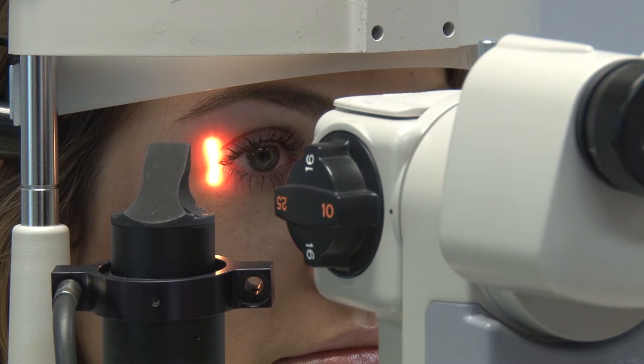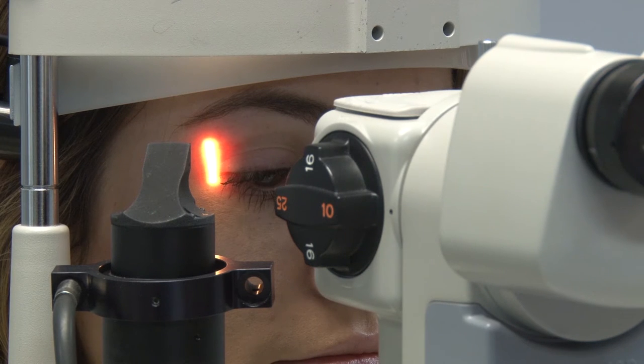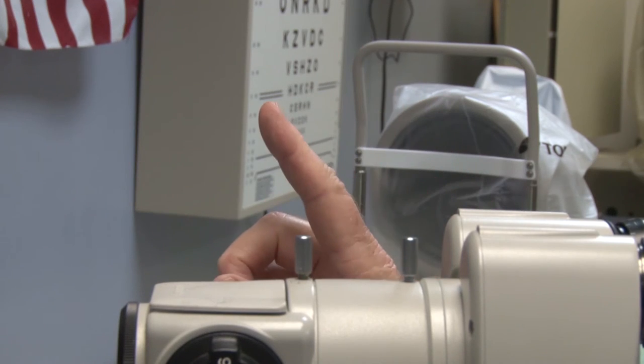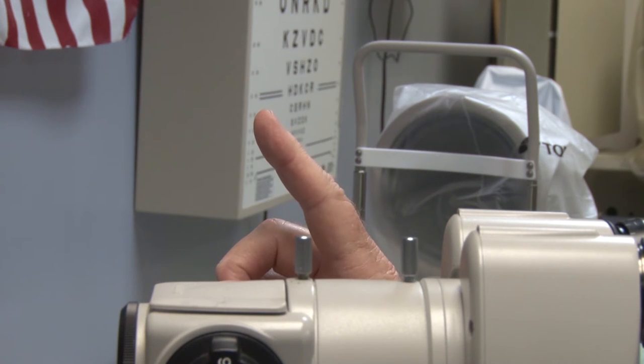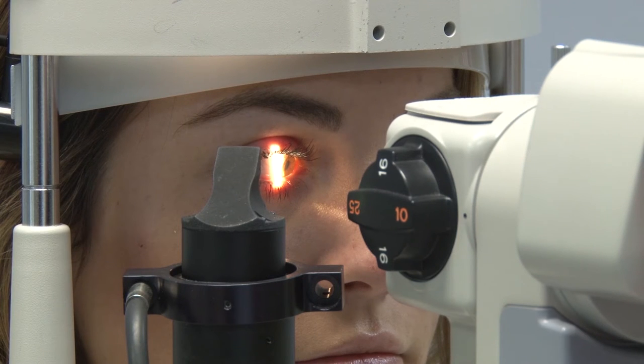On the temporal side, just like the nasal, I'm not going to have to manipulate her lids. I can simply direct her gaze all the way to her left and come in. Taking a nice even sweep, looking for any pingueculae, pterygiums, nevi, conjunctival cysts, and injection, all the way to the limbus and then back out again.